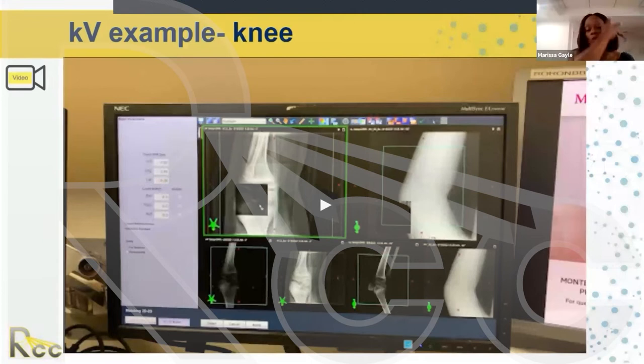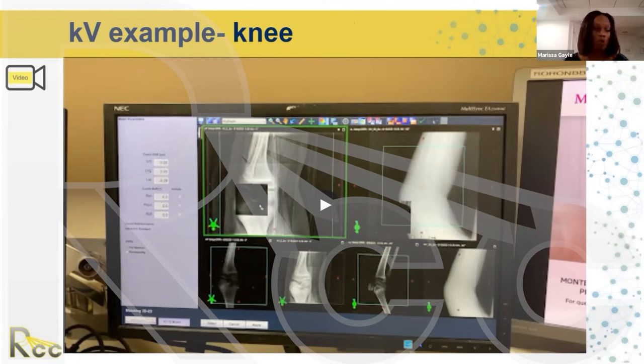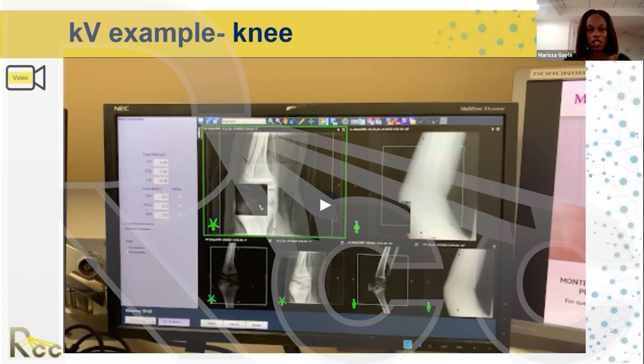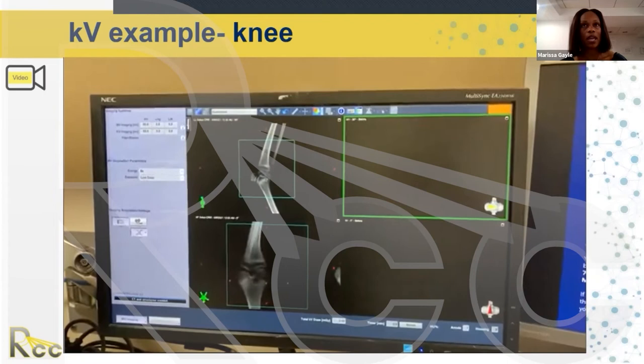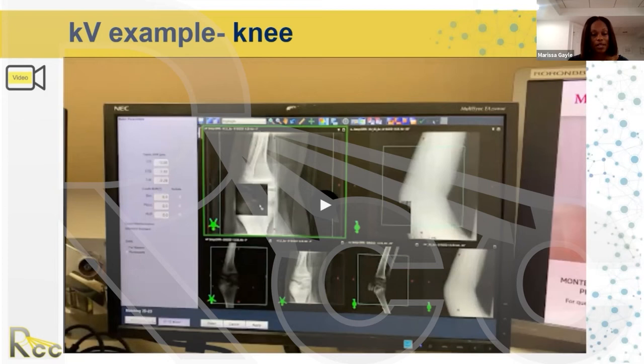The next example is actually my own patient at work — a little boy we were treating for Ewing sarcoma of the knee. For extremities, especially knees and femurs, I find those to be the most difficult setups because you really need a great immobilization device. In this image, the knee is bent. I took both an MV and KV image working on a Varian TrueBeam.